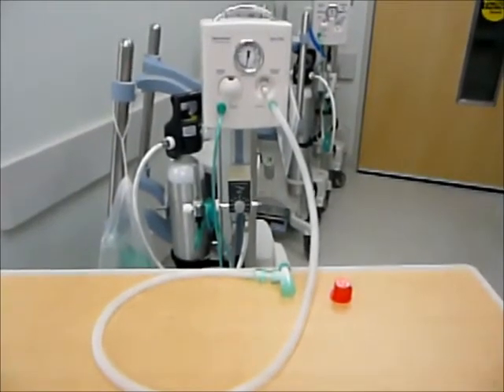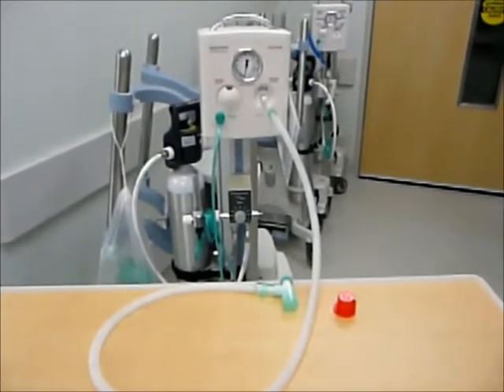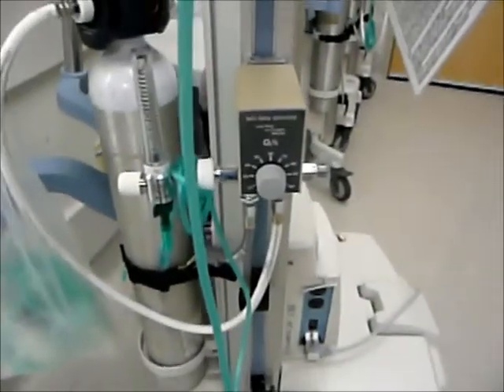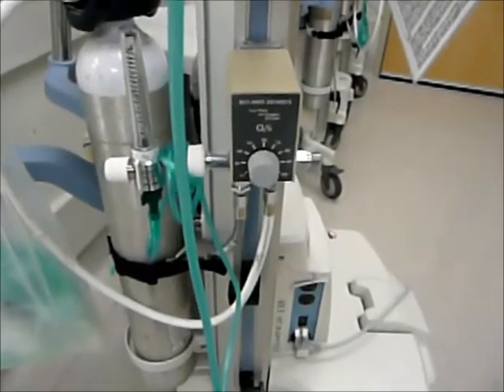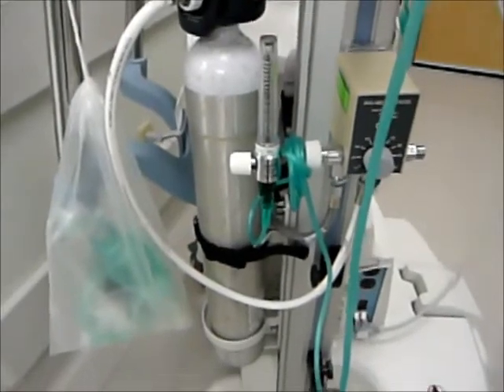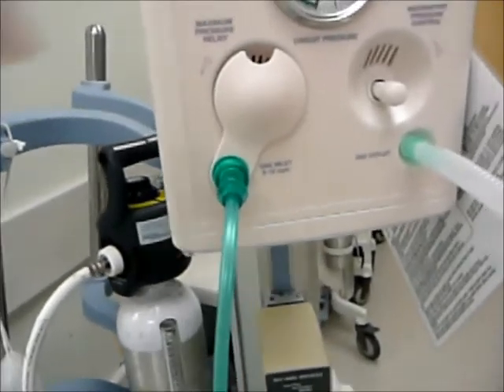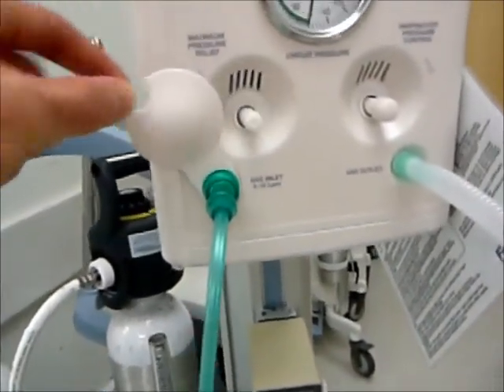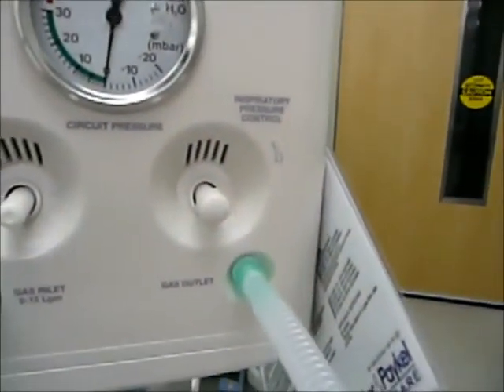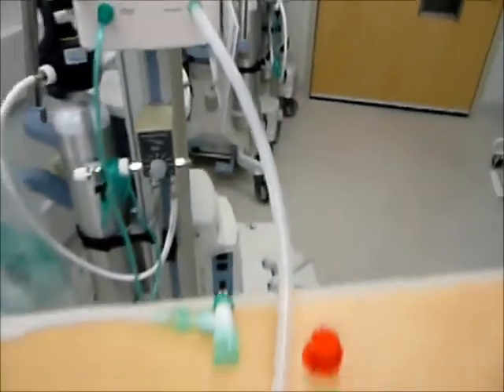This video is going to focus on the T-piece resuscitator. The specific device we have in front of us is called the Neopath infant resuscitator. Looking at the components, first of all we have an oxygen blender which allows us to adjust our oxygen from 21% to 100%. Coming off there we have an oxygen flow meter which is then connected up to our gas inlet of our Neopath. Behind our gas inlet is our max pressure relief, just behind this cover. And over here we have our inspiratory pressure control and our circuit pressure. From our gas outlet we then have our circuit.